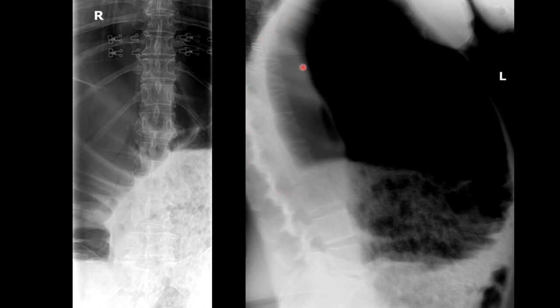The liver is being compressed back, and you can actually see the lung field up here. This is an extreme example and this is a medical emergency.